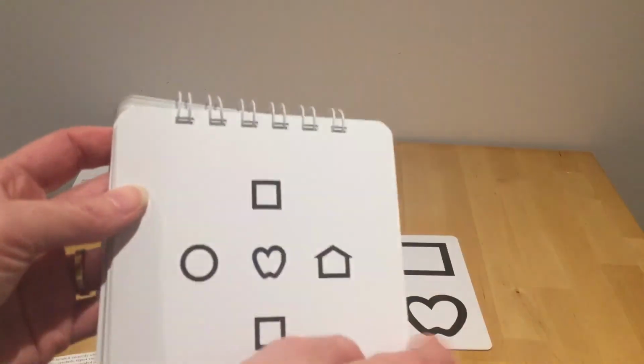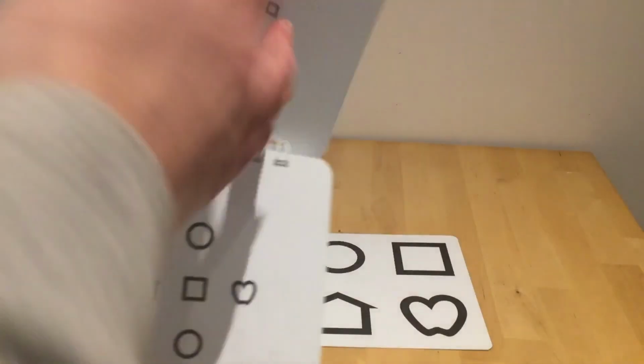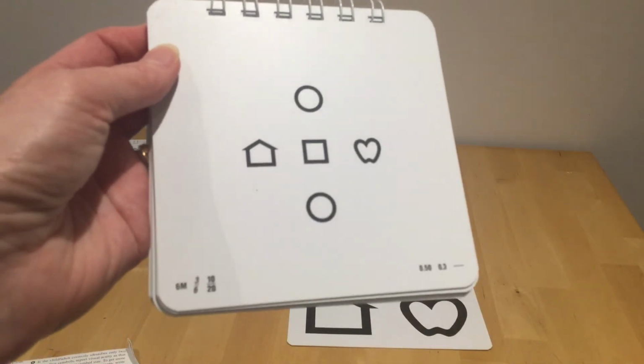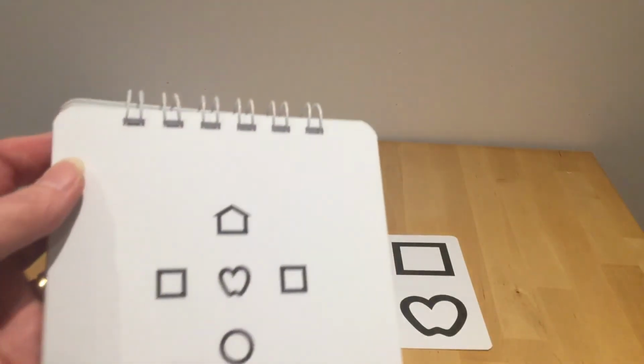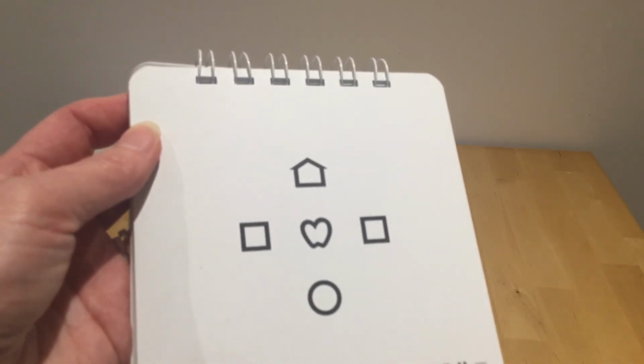So you might want to flip on. Still 7.5. So 3 over 6, what's the symbol on the left? It's the house, and maybe they're struggling a little bit. So maybe you want to ask the next one, and maybe they think that that's a house as well.